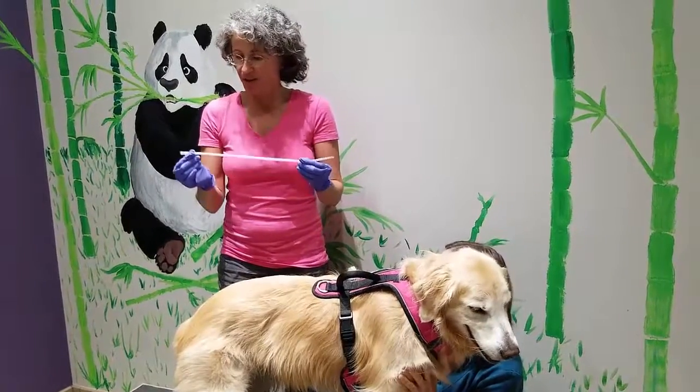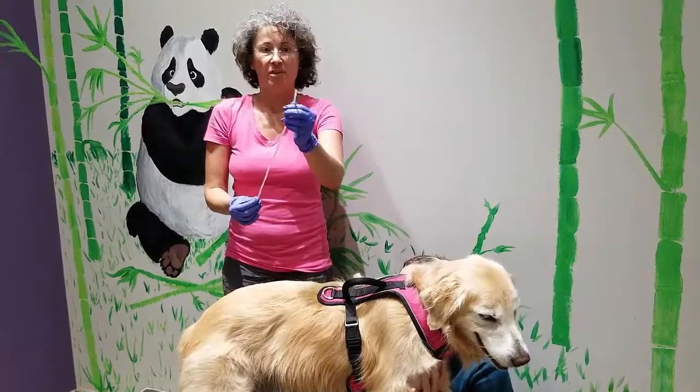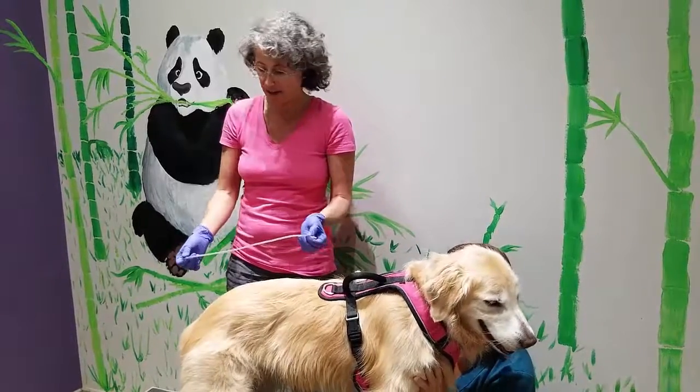The way it works, I have this little tube right here. It's about the diameter of a thermometer and all they feel is it going in through the anus, just like the thermometer, and after that they don't really feel anything.